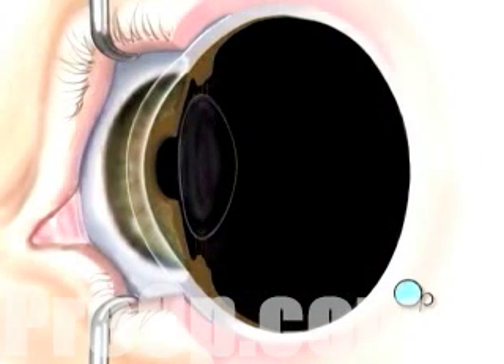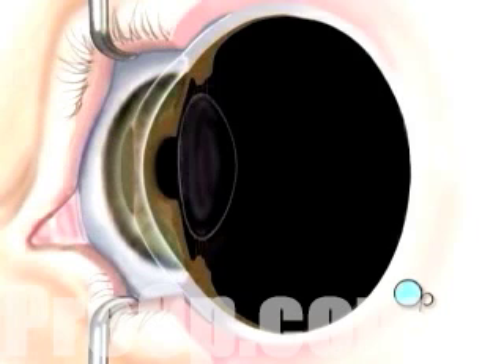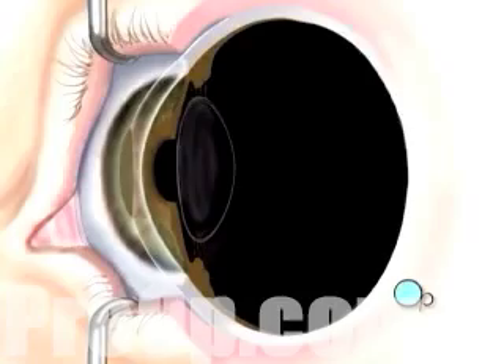Next, your doctor will use a computer to control pulses of cool laser light. These pulses will delicately remove microscopically thin layers of cells from the stroma. By removing tissue in this manner, your doctor will tailor the new shape of your cornea according to the exact nature of your vision problem.